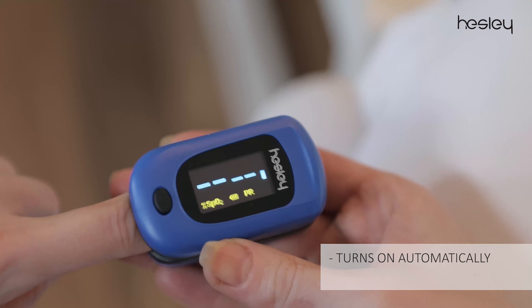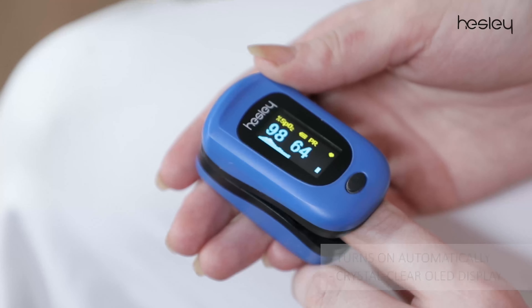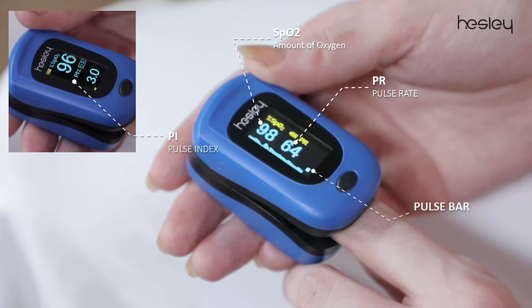The device will power on automatically in two seconds, as its crystal clear OLED display will show you the accurate SpO2, PR, PI, pulse bar, and waveform.